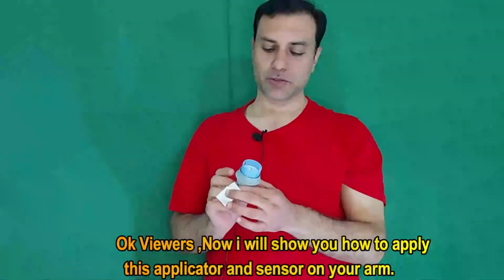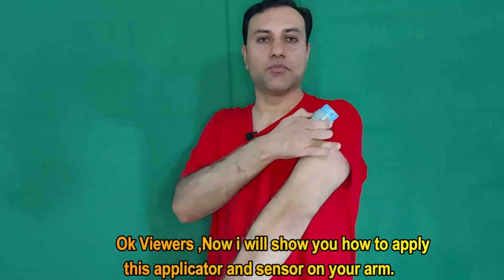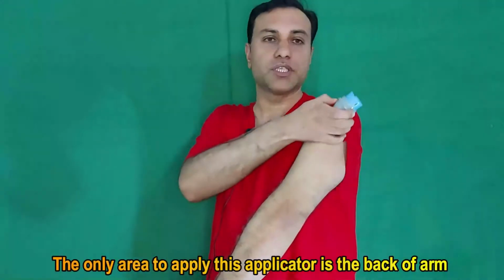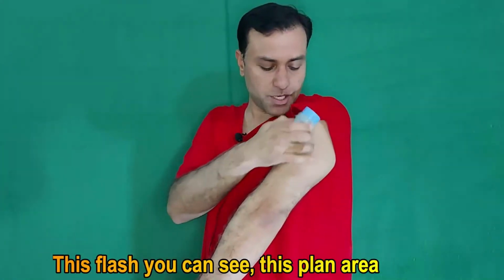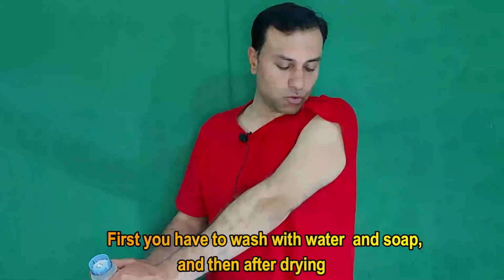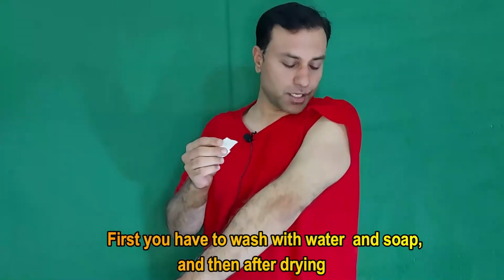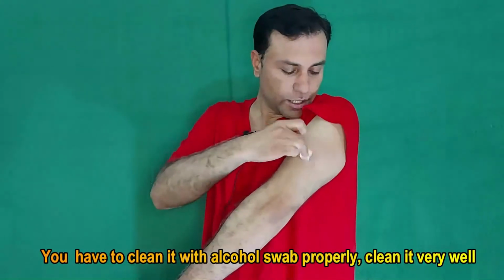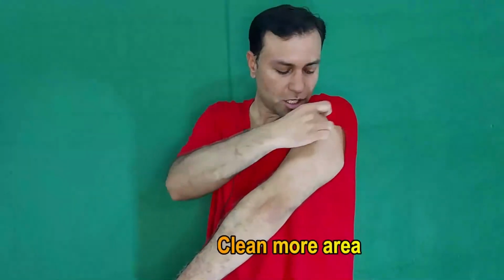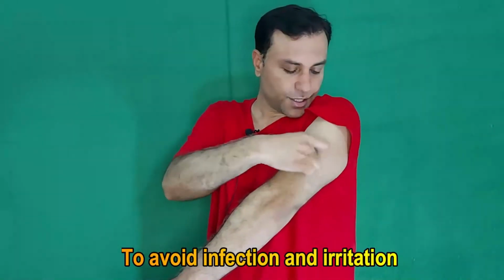Okay viewers, now I will show you how to apply this applicator and sensor on your arm. The only area to use this applicator is the back of your arm. This fleshy part, you can see, is the plain area. First you have to wash with soap and water, and then after drying you have to clean it with the alcohol swab properly. Clean it very well. Clean more area to avoid any infection and any irritation.